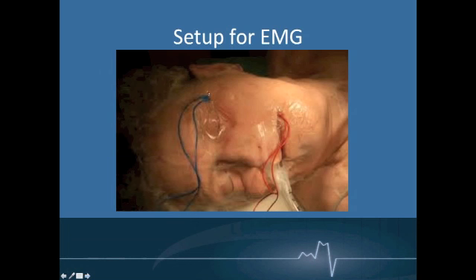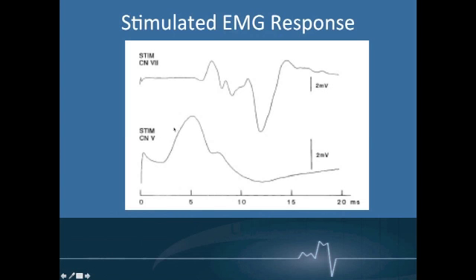Here's an example of people who just set up oculi and oris, it looks like. Look at this. This is a nice figure just to show you. This was done at the brain stem. And here's cranial nerve 5 stimulated, CMAP. If you hear my kid in the background, I do apologize. I've got 4 of them, and so we're going to get one at some point. And here's cranial nerve 7 coming in at approximately 7 milliseconds.